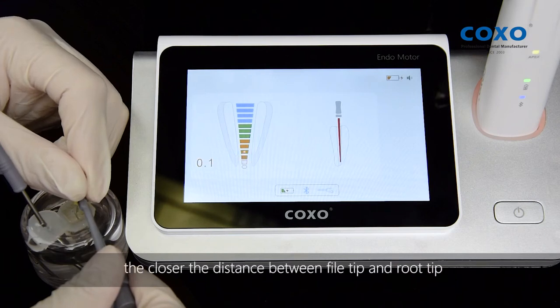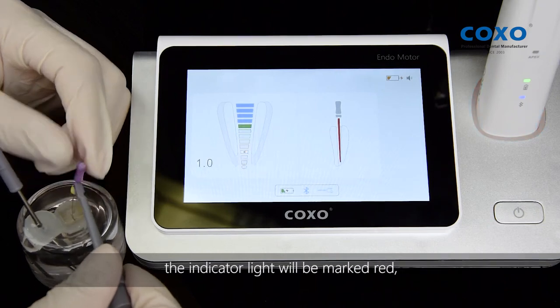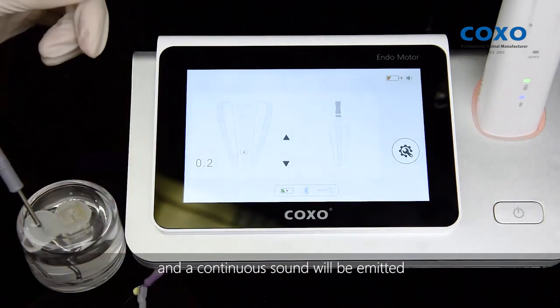The shorter the sound interval, the closer the distance between file tip and root tip. When the tip of the file reaches the apical hole, the indicator light will turn red and a continuous sound will be emitted.